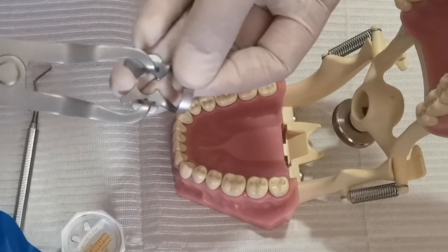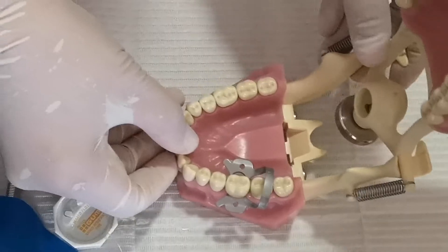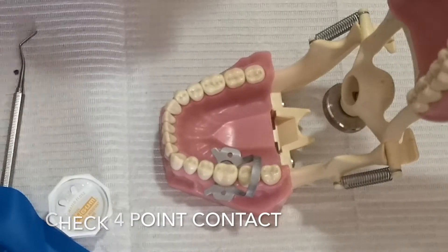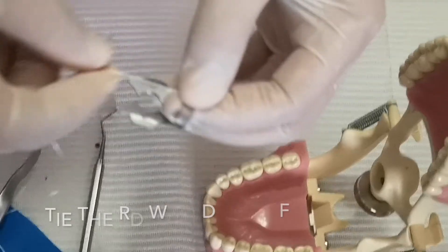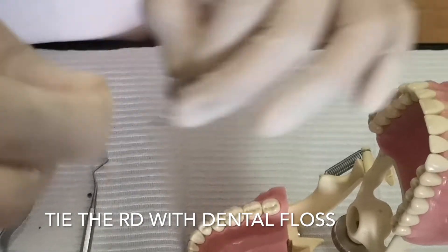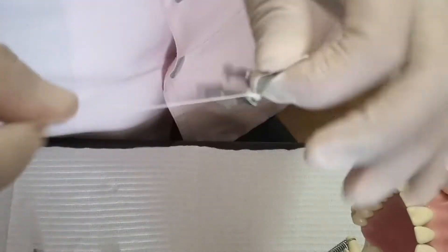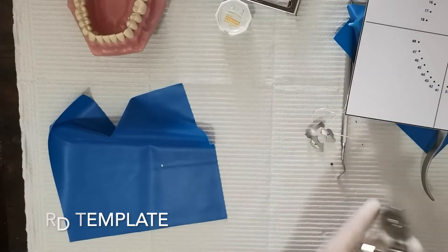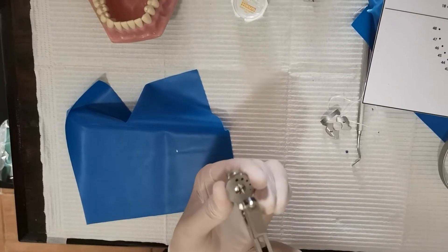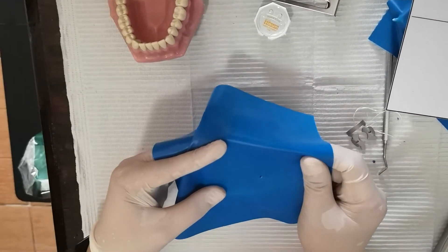All I have to do is the pre-fitting. Fit it, insert it, and then check the lingual side. Check the four-point contact — it should be stable. Once you have the four-point contact, remove it and tie the dental floss, repeating five times so it is secured. For tooth 36, get your rubber dam punch and place it on the biggest hole. Go up and down. Make sure there are no nicks and no tags.